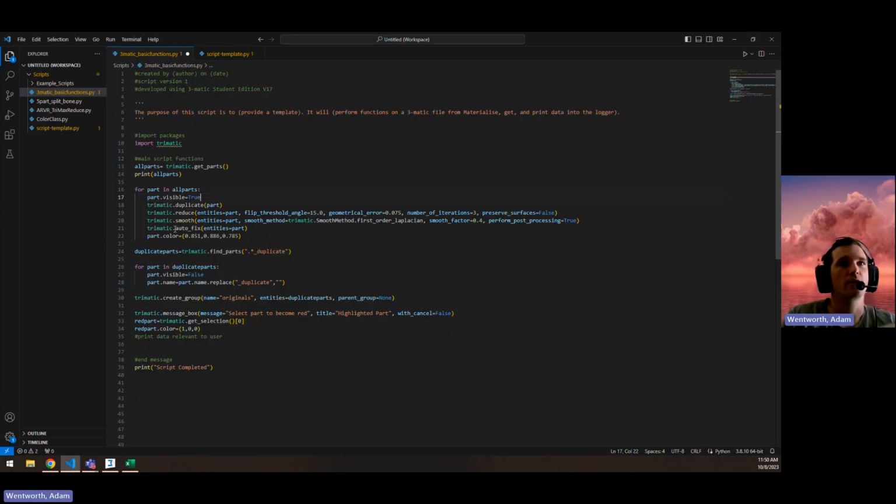Then we're running some basic functions like reducing the number of triangles, smoothing the mesh, and auto fixing the mesh. And then it changes the color of that part to something that looks like a bone color. And you notice it's kind of weird. It's what's supposed to be here is like RGB values, but normalized from a value of 0 to 1. So in order to find out what the value you actually want in there is, you got to divide each of those RGB values by 255.